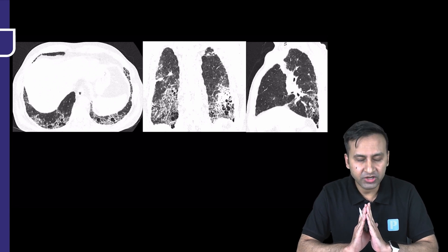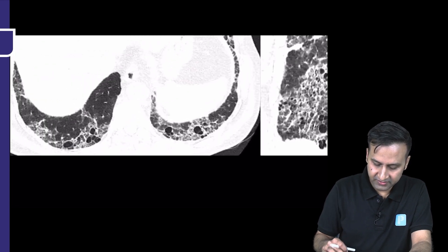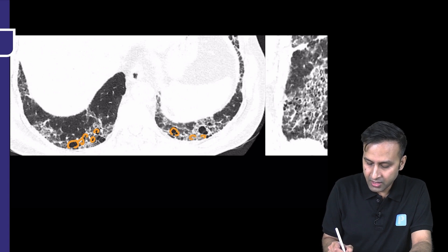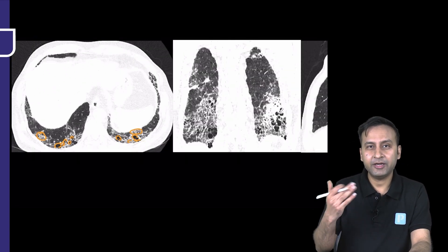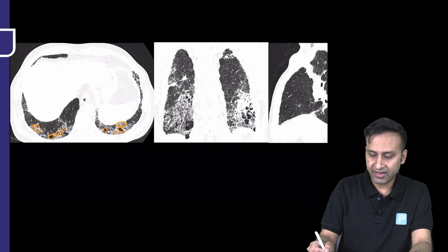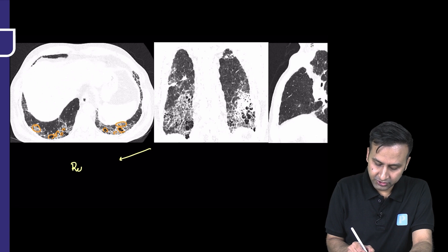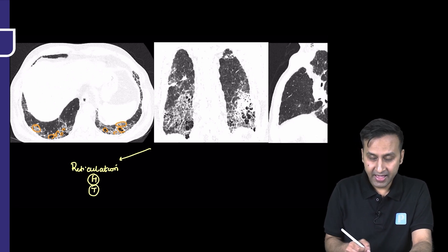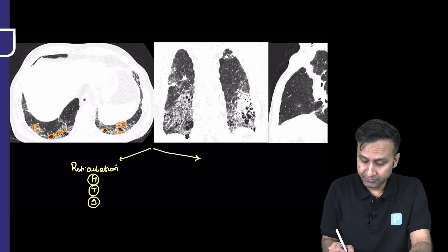These are the three most important images from this volumetric scan. We can see honeycomb cysts located peripherally, stacked one over the other, bilaterally and almost symmetrically, associated with some areas of ground glass opacities. Now, is the predominant pattern honeycombing, reticulation, or ground glass opacity? In reticulations we can have honeycombing (H), traction bronchiectasis (T), and septal thickening (S). A second group might say the predominant pathology is ground glass opacification.